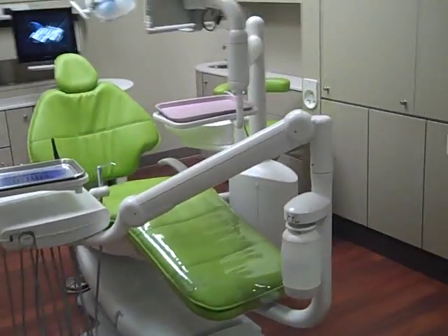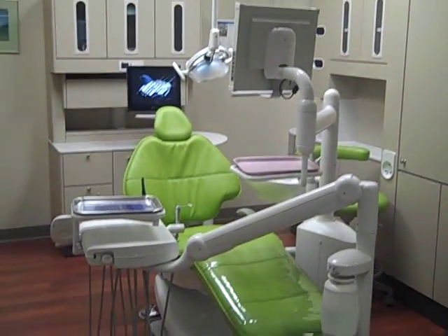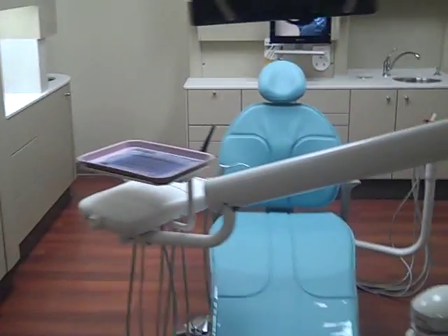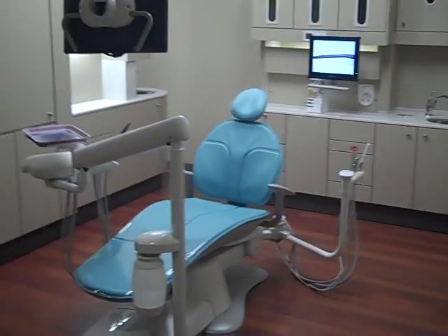As the patient, do you feel like there's not much going on here? Lime green action. Thank you.